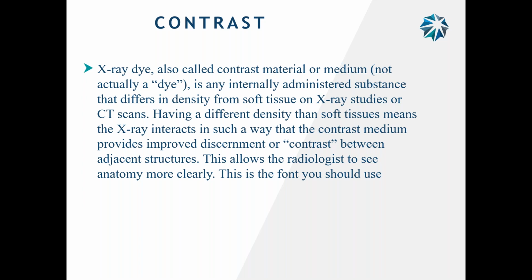So the contrast, the fluid that is put into the body, helps to distinguish soft tissue. And that is used for a lot of interventional radiology for blood clots and blockages, or CT to find calcified objects or tumors. That's another one. And it's used tremendously in heart catheterizations. Tremendously. So contrast is not a dye. It's a clear liquid that blocks X-ray.